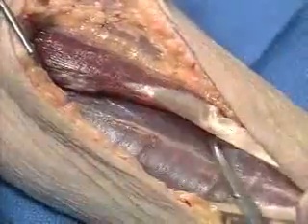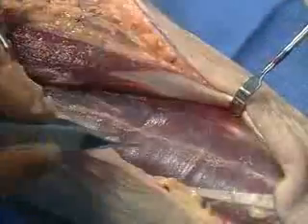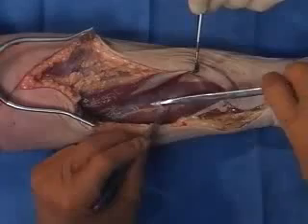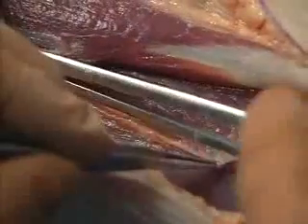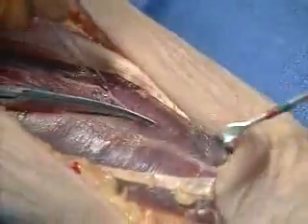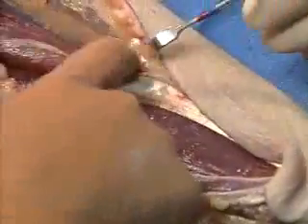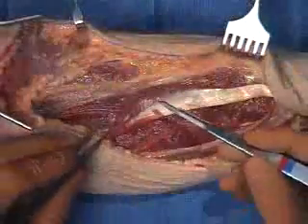Great. Now, depending on the clinical situation, the individual forearm musculature has well-developed fascia, and so you may elect to release the individual muscle fascia. Okay. So we released our volar compartment.